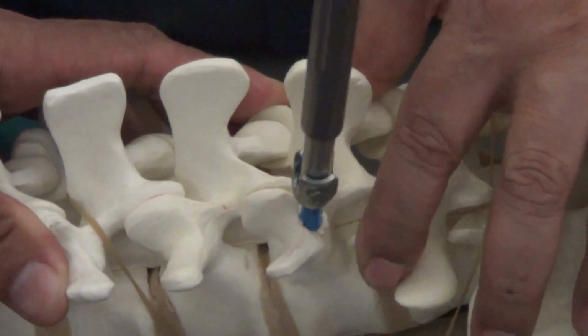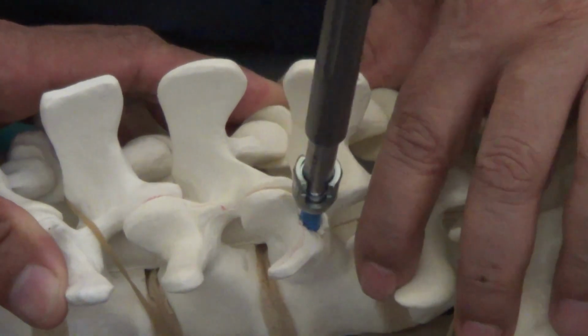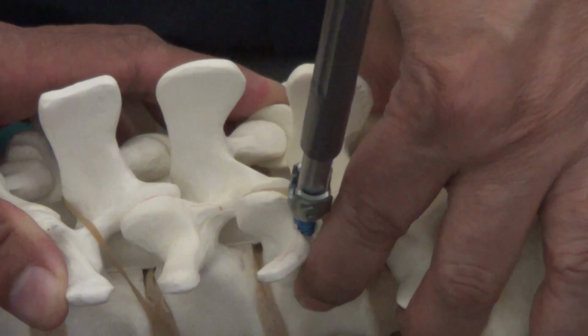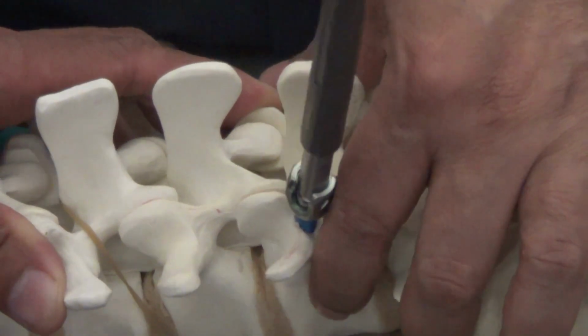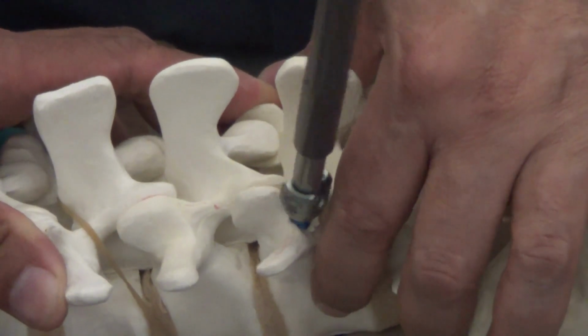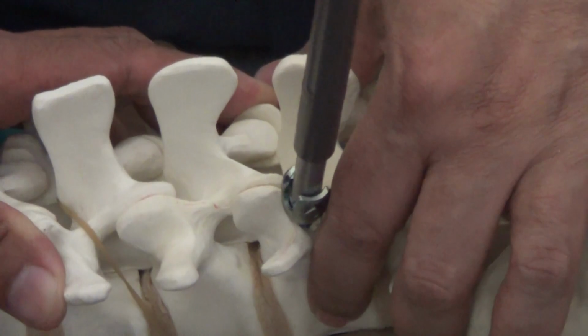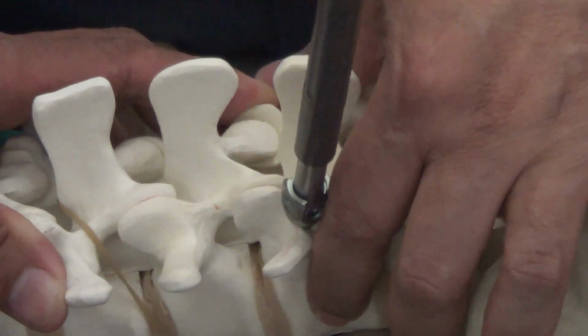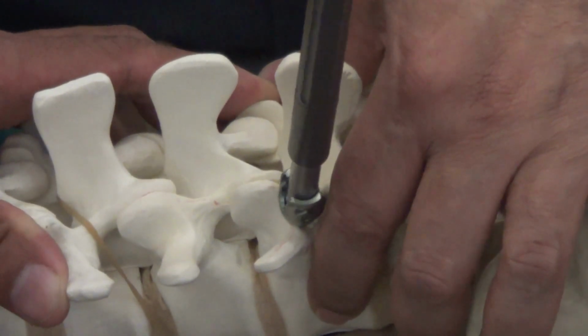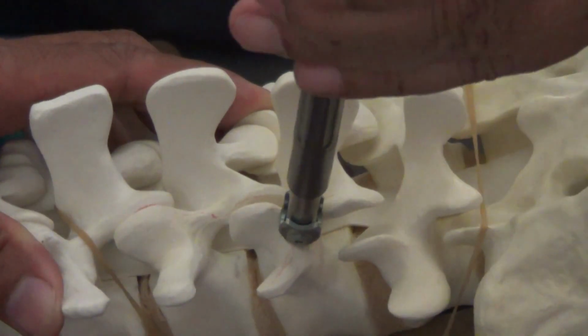It's always better to angle it about 20 degrees inwards. Now the earlier screw design was made by Steffee, where he would go vertically in, and the entry was more medially at the base of the facet. But Roy Camille type of an entry is slightly angulated in. The pull out of the stem of the screw becomes better.